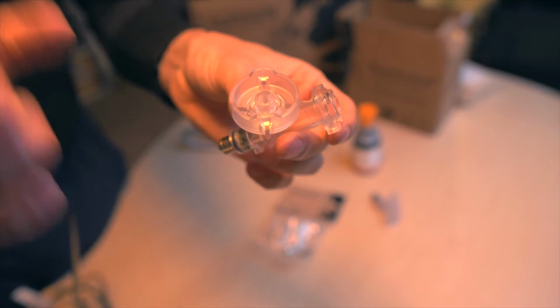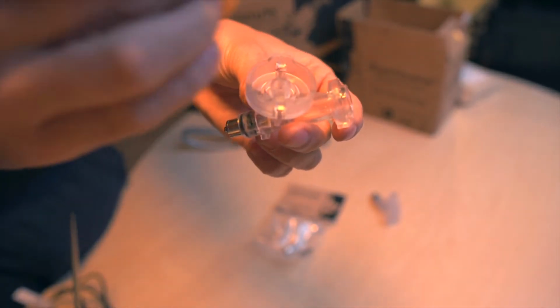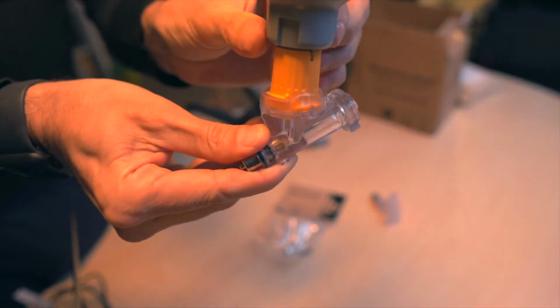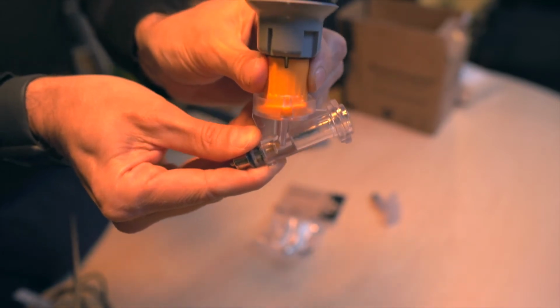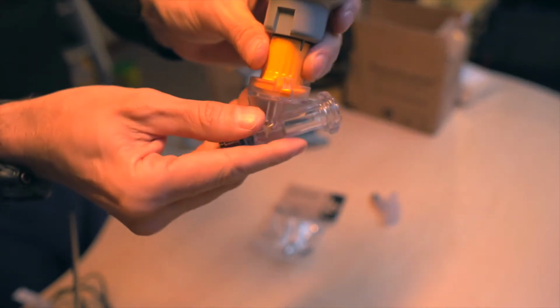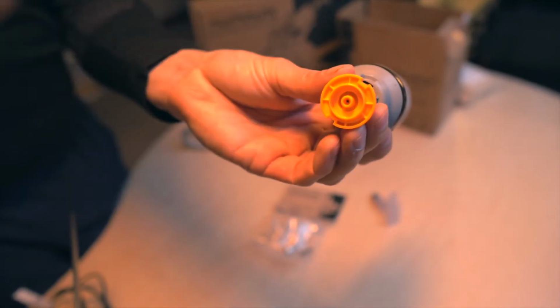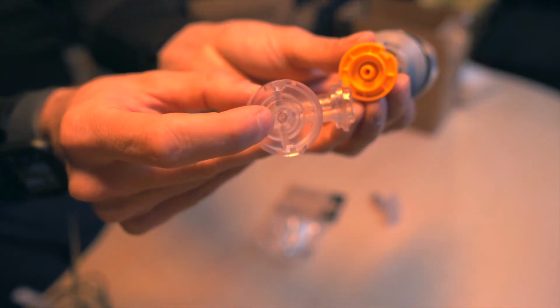A really useful tip with the fluid junction is when you attach the Nummucaine to it, you don't have to tighten the fluid junction right up to the hilt. You only need to use your thumb and forefinger and just make it sort of firmly tight there. You don't need to grab the whole bottle and graunch it right round. The reason for that is that the sealing obviously happens between this orange surface here and the inner surface, the clear surface on the inside there.